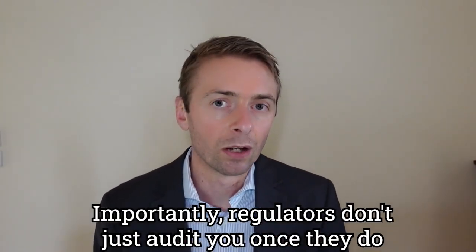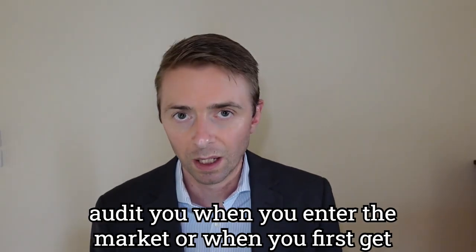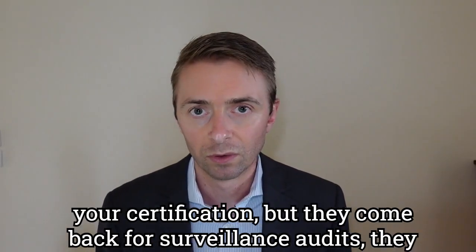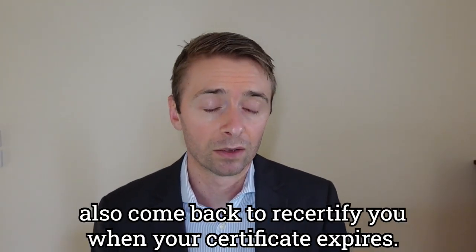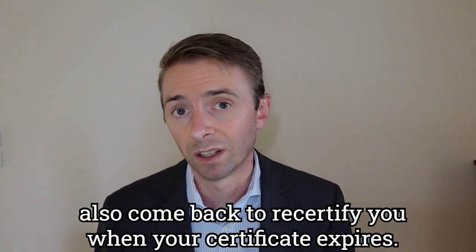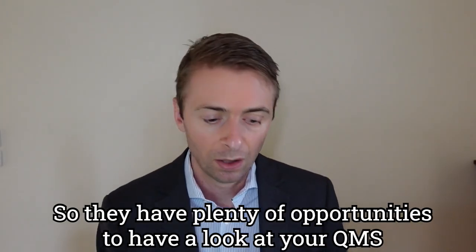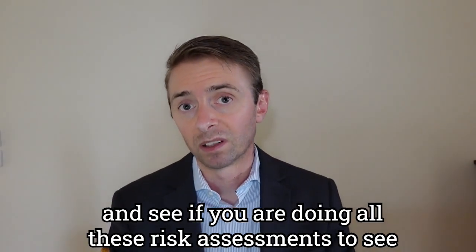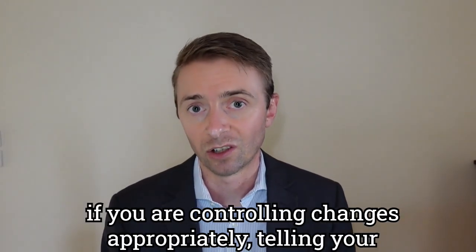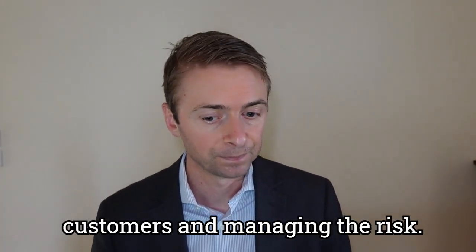Importantly, regulators don't just audit you once. They do audit you when you enter the market or when you first get your certification, but they come back for surveillance audits. They also come back to recertify you when your certificate expires. So they have plenty of opportunities to have a look at your QMS and see if you are doing all these risk assessments, to see if you are controlling changes appropriately, telling your customers and managing the risk.